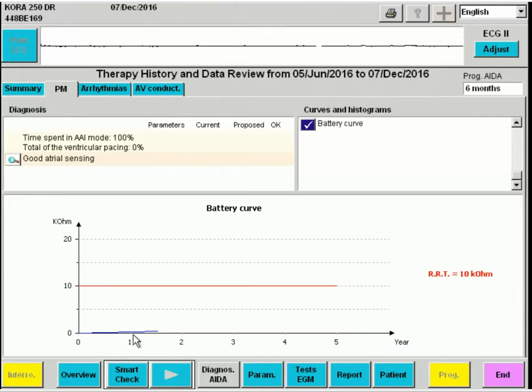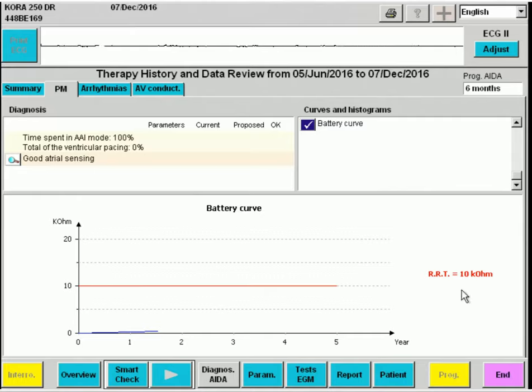We can see that the battery impedance remains under 1 kOhm. After a while, this curve will rise and reach the red bar at 10 kOhm when replacement is indicated. Using these screens, we have a global impression of the functioning of the pacemaker, but it is important to still separately test the leads.